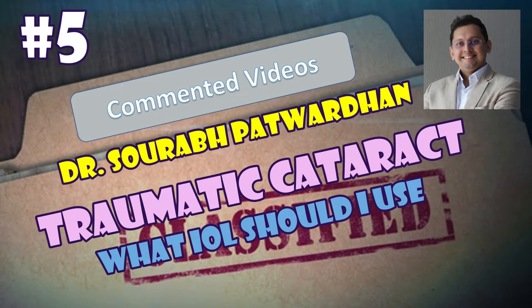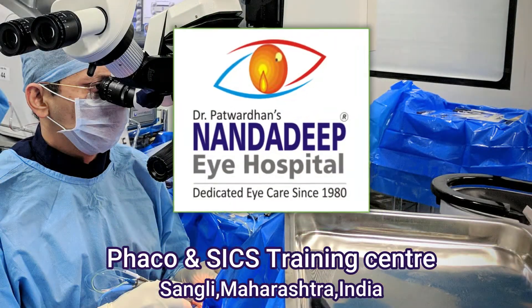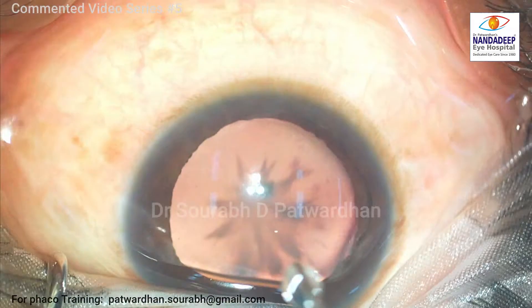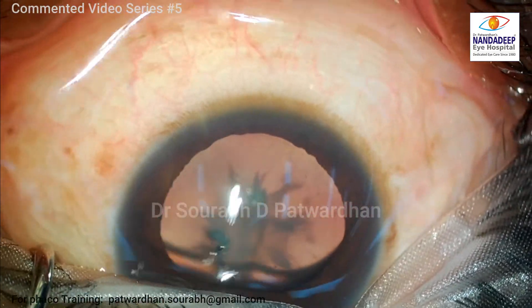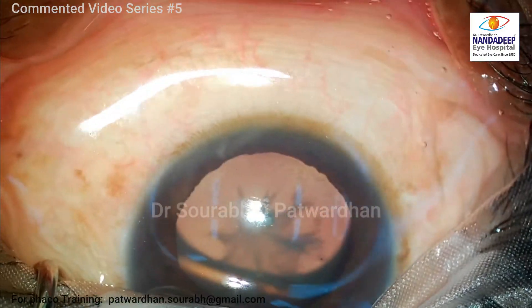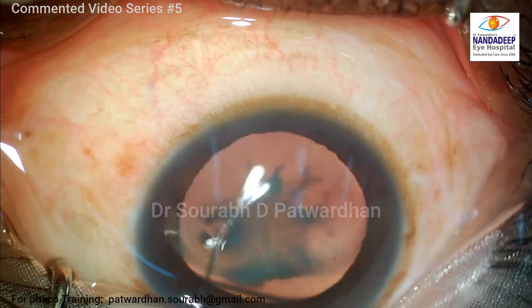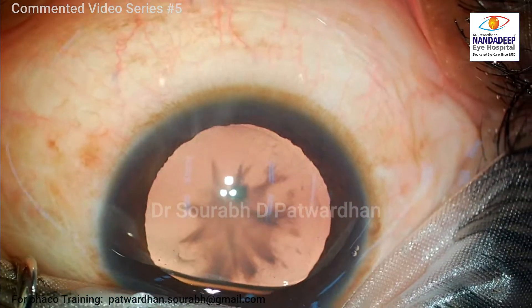Hello, I am Dr. Saurabh Patvardhan from Nandadi Pai Hospital and FECO Training Center. In this commented video series, video number 5, I will be speaking about a young patient with unilateral traumatic cataract. This patient perhaps had some injury in childhood and developed a rosette type of traumatic cataract, and I am going to operate on it.